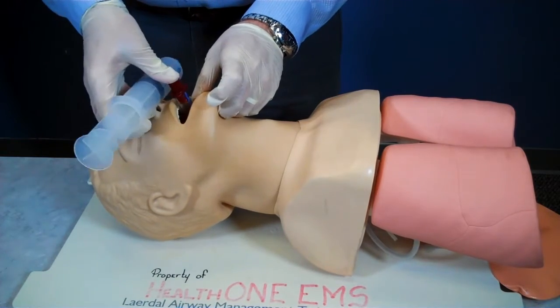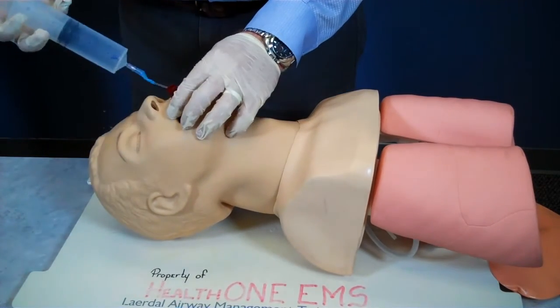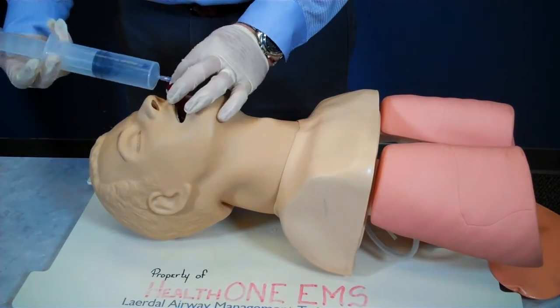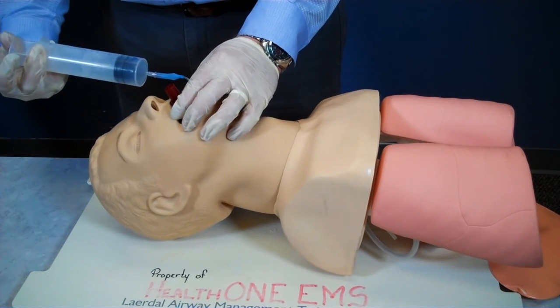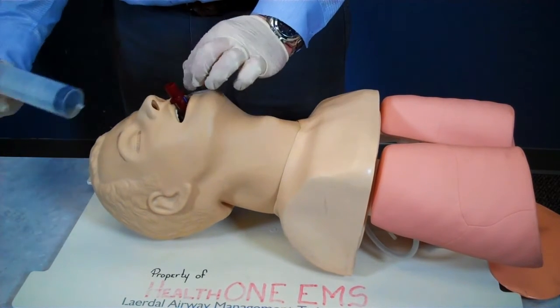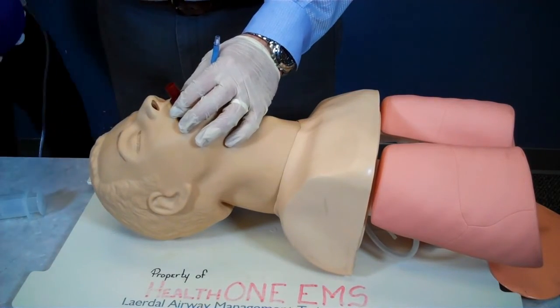I insert the device to the proper depth and inflate the cuffs with the proper volumes of air using the supplied syringes. Once the cuffs are inflated, I immediately remove the syringe to ensure the cuffs do not deflate.